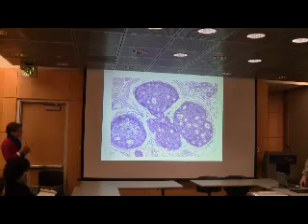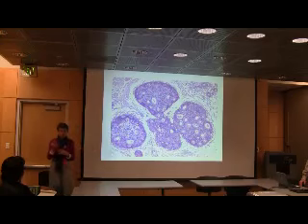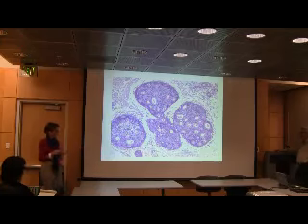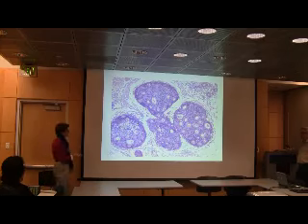All right, so we saw a high end of carcinoma in situ. Now this is the low end. So here the pattern is very different. We still have very dilated structures, but the cells are much smaller. The nuclei are small and round, and they look very similar to what benign cells should look like. But there are too many. It's too piled up, and the structures are dilated to a great extent.